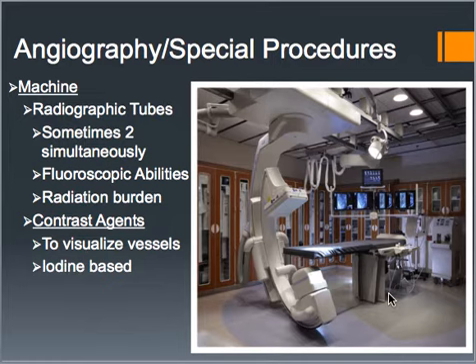So during the procedure, the technologist and the doctor will remain at the table side. Usually they both work on the same side, or one works on the other. So they're going to be doing that to operate the angiography system, which is controlled down here, and then to work with the catheters, contrast, and related devices. So it just depends on the procedure, the doctor, things like that, but some facilities might even have two technologists, one to run the machine and one to assist the doctor that's sterile as well.